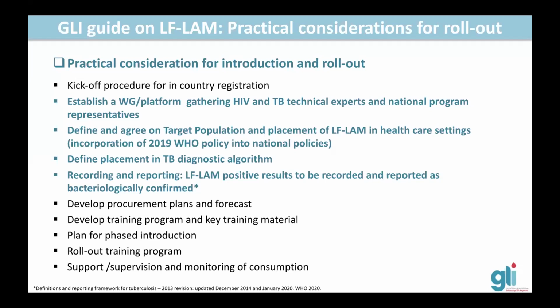It's really important to define and agree on the target population and the placement of lateral flow LAM in healthcare settings, to define the placement in the diagnostic algorithm. So as we said, we have templates, but they need to be adapted to the local context.